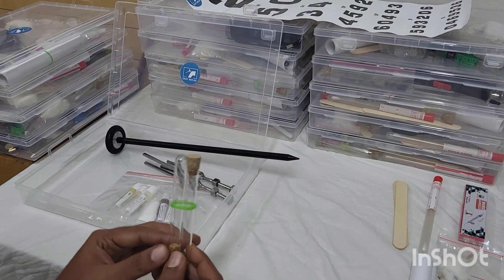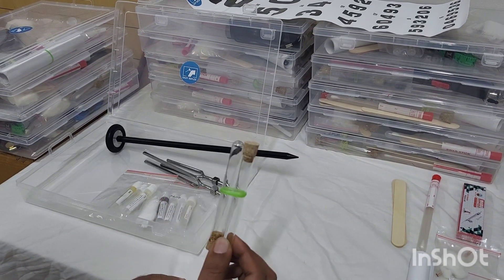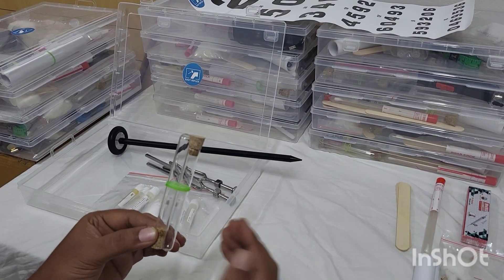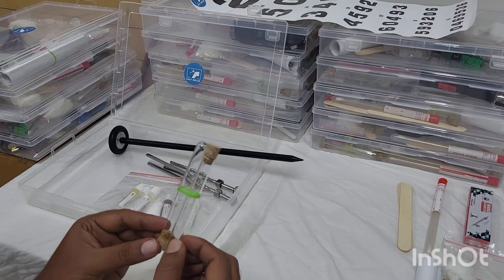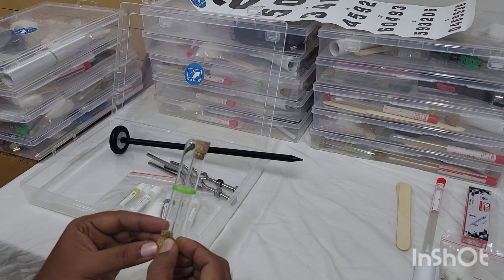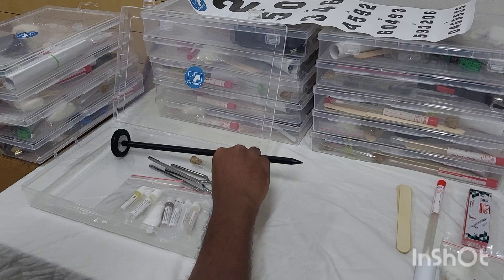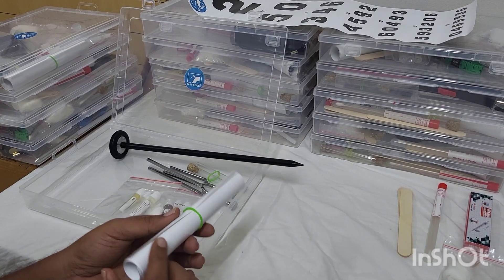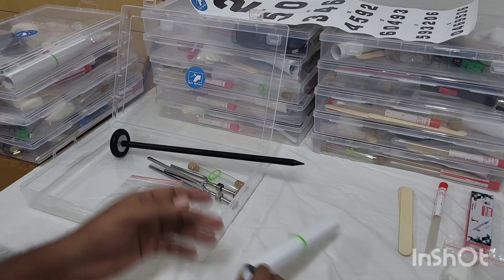Next we have given you two glass test tubes — they are not plastic, they are true glass, so they will be able to conduct temperatures like heat as well as cold in a better manner, with a cork. You can use these for hot water testing as well as cold water testing for the spinothalamic tract.